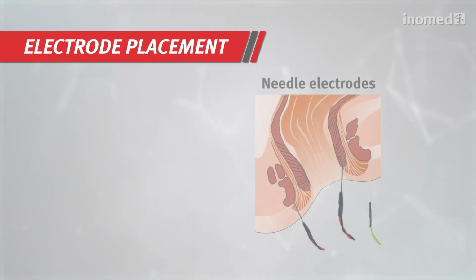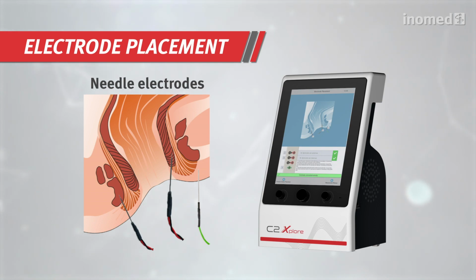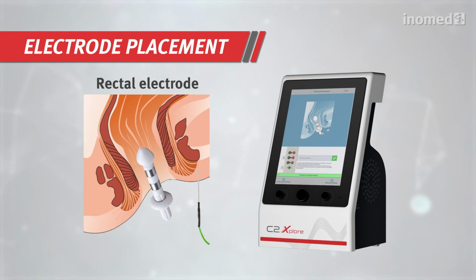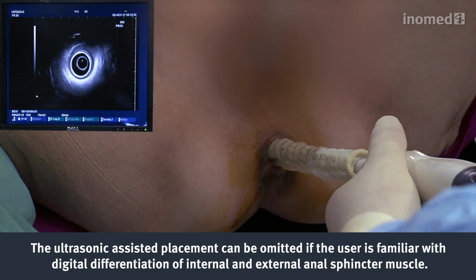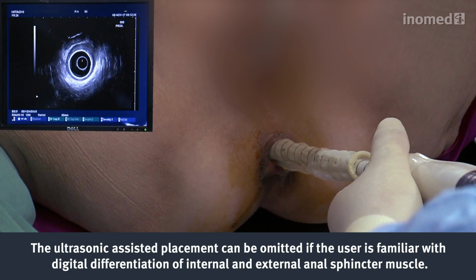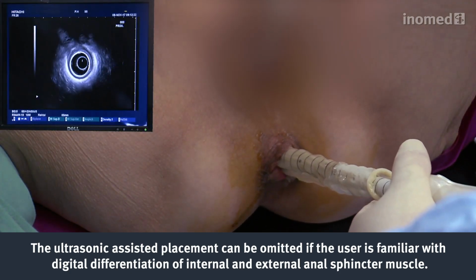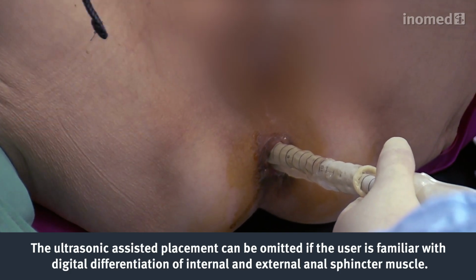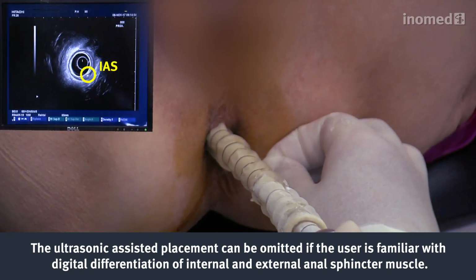Now the electrodes can be inserted into the tissue, either by inserting 2 needle electrodes for 2 separate measurements into the external and internal anal sphincter, or by inserting 1 rectal electrode for a surface measurement of the activity of both muscles. A digital differentiation between the external and the internal anal sphincter is possible. Alternatively, an ultrasonic guidance can be used. Once the internal anal sphincter has been found, the first bipolar needle electrode can be inserted.